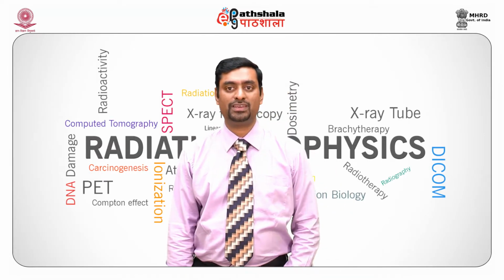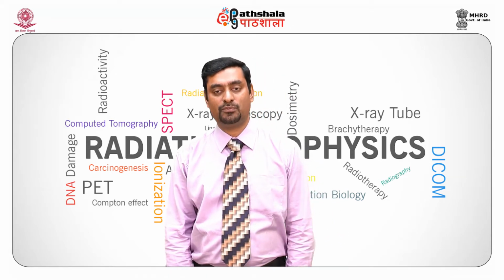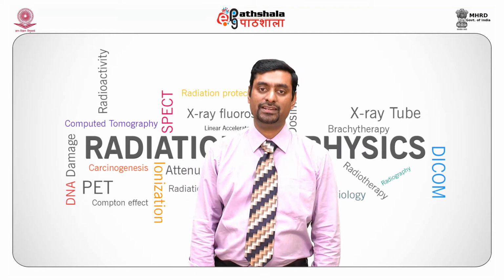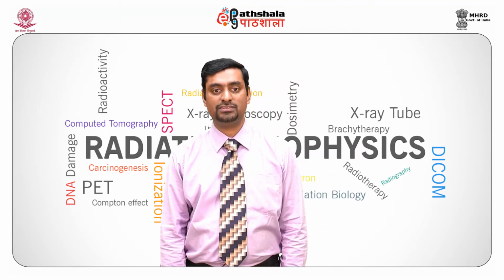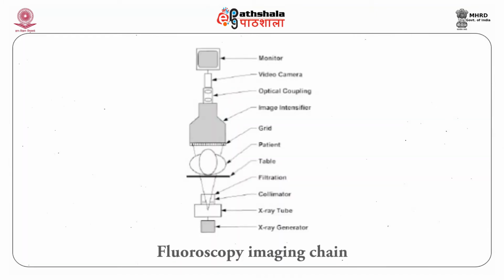Next, we move on to the fluoroscopic imaging chain, which is part of our objective. Till now, we learnt about how conventional fluoroscopy works. But image intensifiers were introduced in the 1950s. They allow fluoroscopic images to be visible under normal lighting conditions. So what are the components of this fluoroscopic imaging chain? From this illustration, you can see it has a generator, X-ray tube, collimator, filtration, a table for the patient, and the patient, grid, image intensifier, optical coupling, video camera, and finally a monitor to visualize the image.